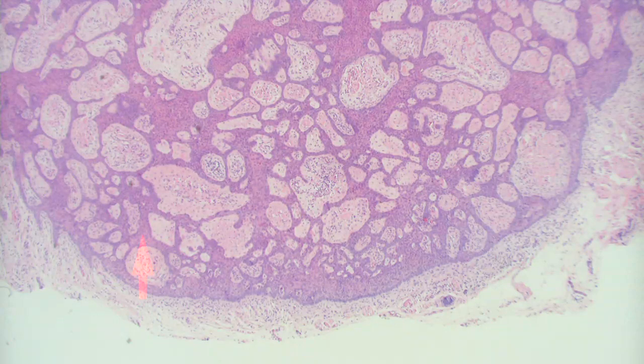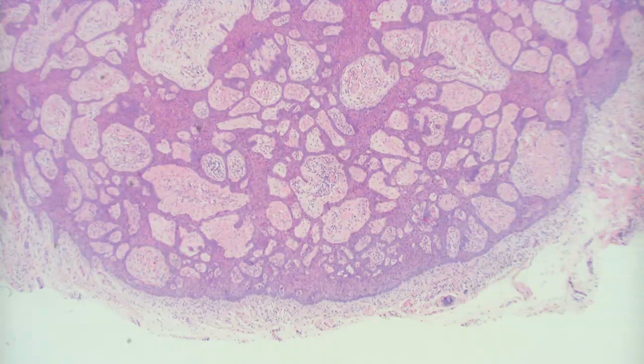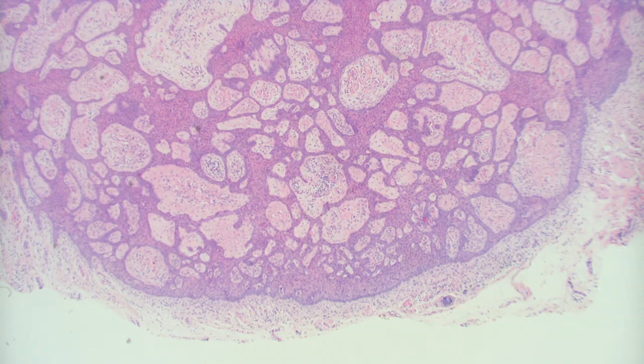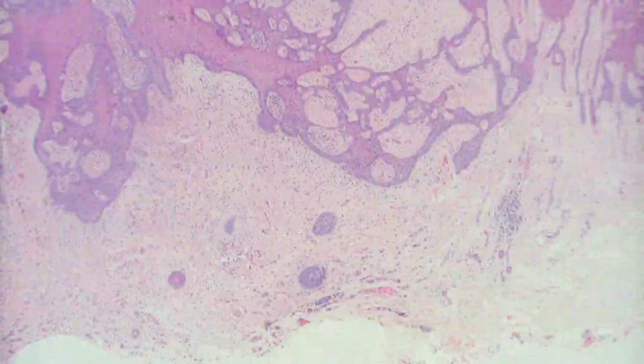So, when the hair follicles undergo cycling, they shrink up and end up at that site, and then those stem cells at that mantle zone repopulate the lower portion of the follicle, and it grows down that little fibrous sheath, and then you get a new hair follicle. So sometimes you get neoplasms that form in that area. So this is a neoplasm, these little primitive follicular structures that most likely normally reside in the mantle zone area.